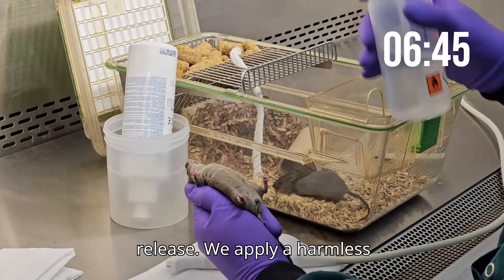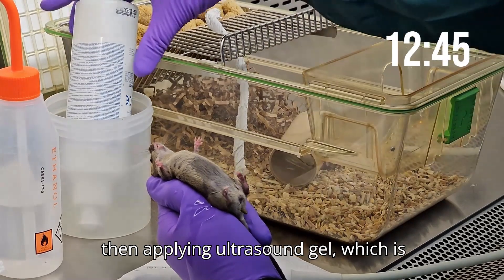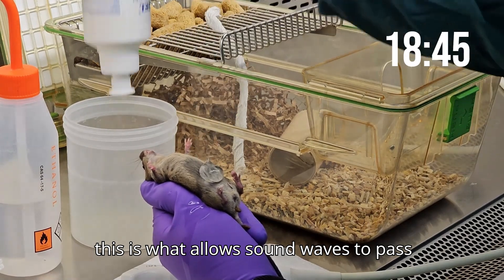We apply a harmless 70% ethanol solution to the belly to remove any possible air bubbles, before then applying ultrasound gel — the same one that is used on humans — and this is what allows sound waves to pass through the body.